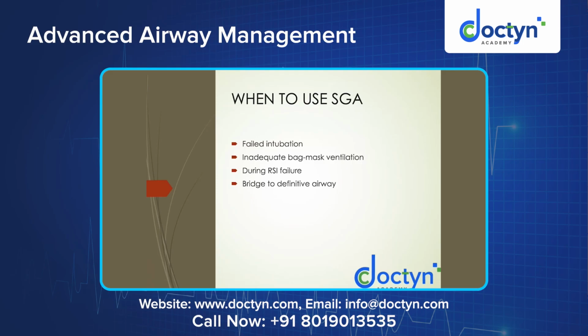So now, what I have said, the oxygenation is paramount. The moment you realize that there is a failed intubation, you just get back to maintenance of oxygenation, because during any attempt to establish intubation, the endotracheal tube inside or LMA, it could be 30 seconds, 1 minute, 2 minutes, sometimes more than that, we are not providing any oxygen to the patient. So this is what you have to remember very much.